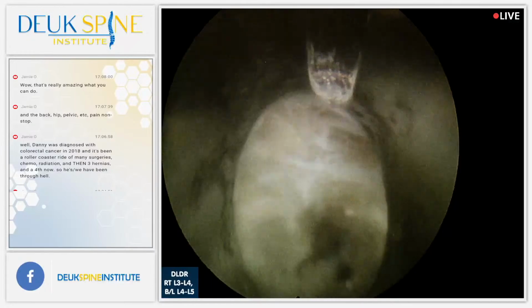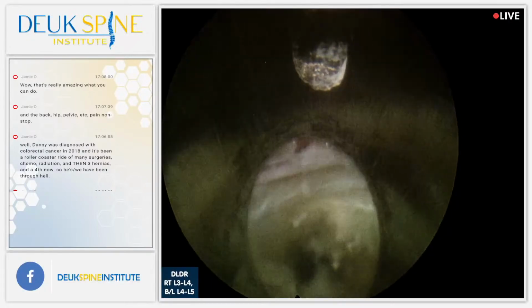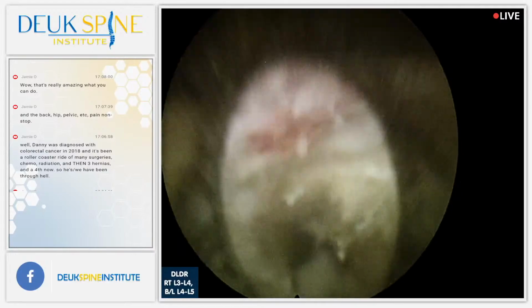There's the nerve and the fat right there. See how small the hole is now that we're finished? It's about 3 millimeters.